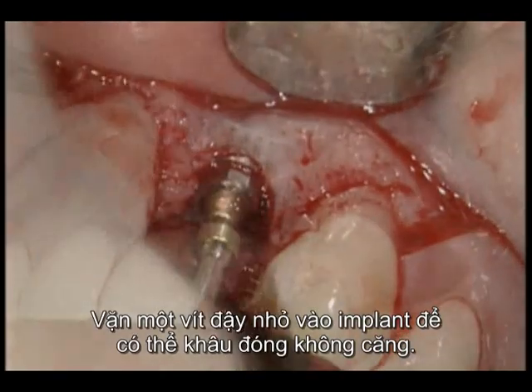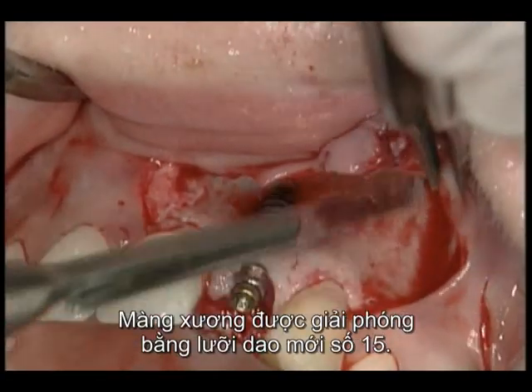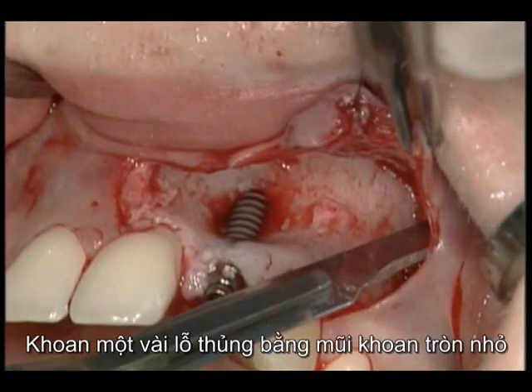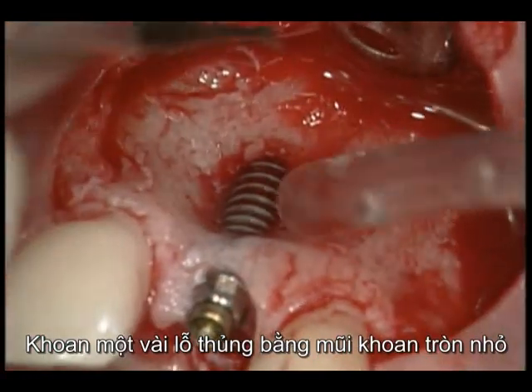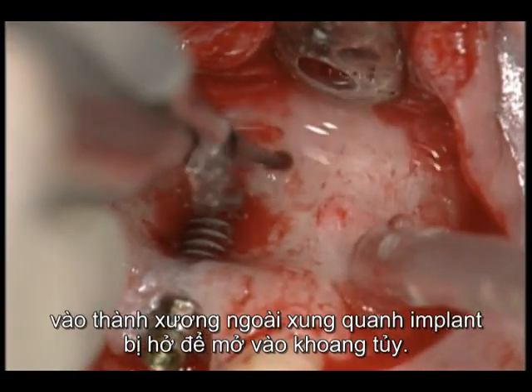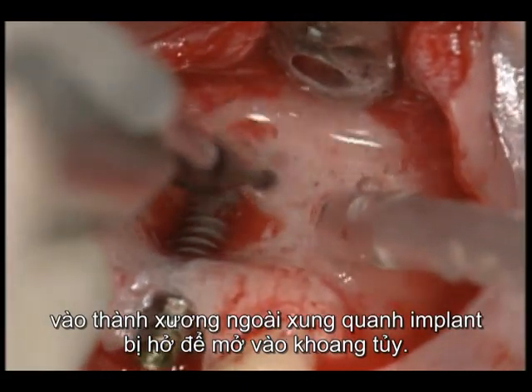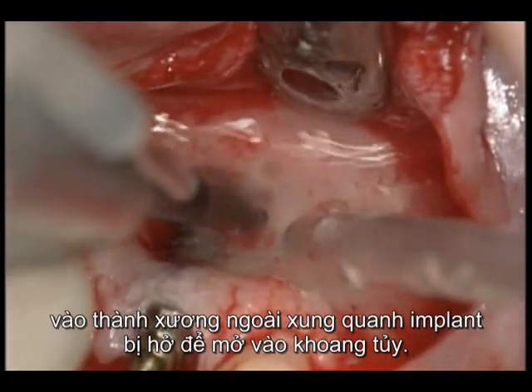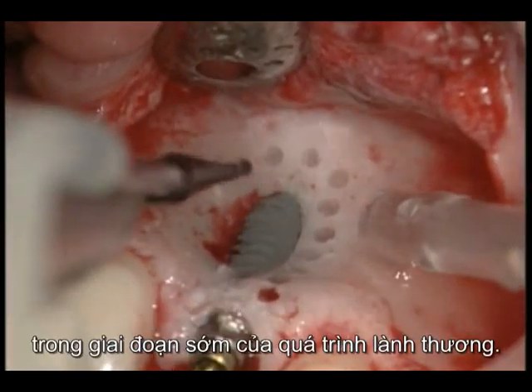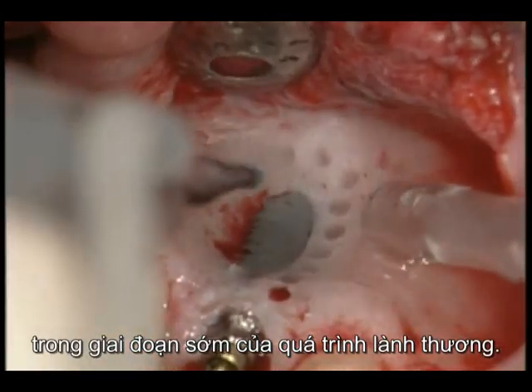To achieve tension-free closure, the periosteum is released with a new number 15 blade. Several perforations are prepared with a small round burr into the facial bone wall around the exposed implant to open the marrow cavity. This opening will help the ingrowth of blood vessels during the early stages of wound healing.